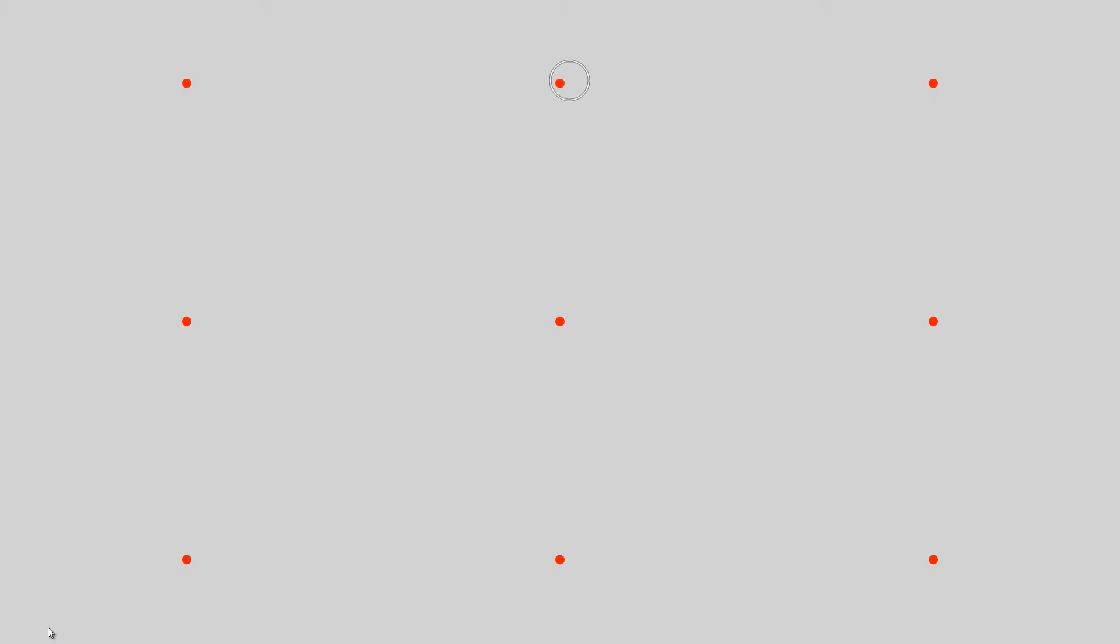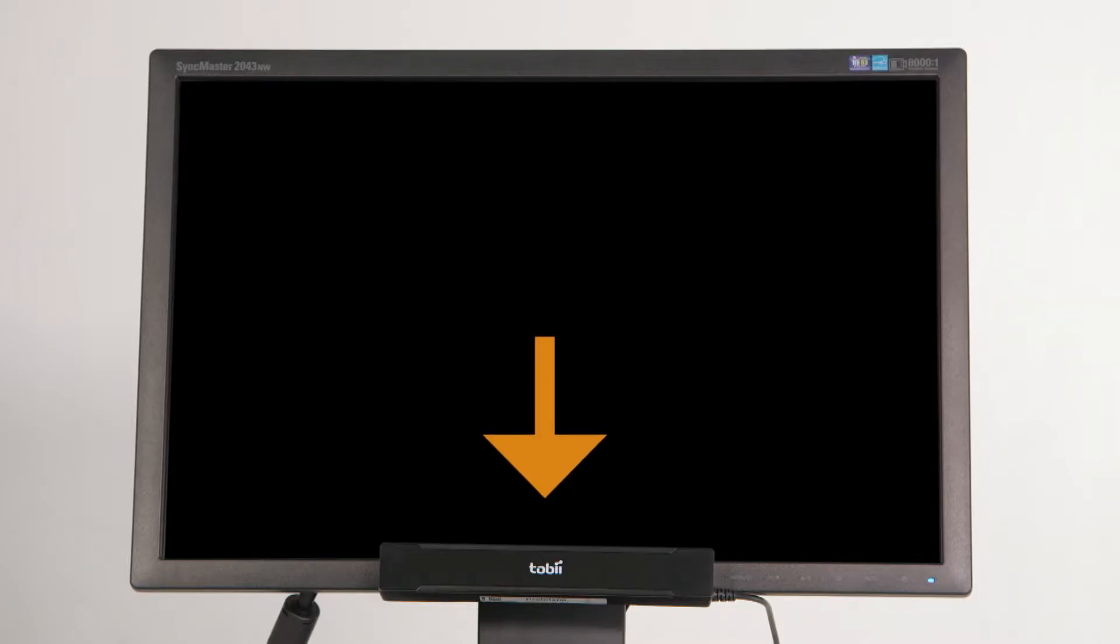To be able to take good photographs of the eye when the person in front of the eye tracker is looking anywhere on the screen, the eye tracker must be mounted below the display area of the screen and look up into the eyes of the person being tracked.